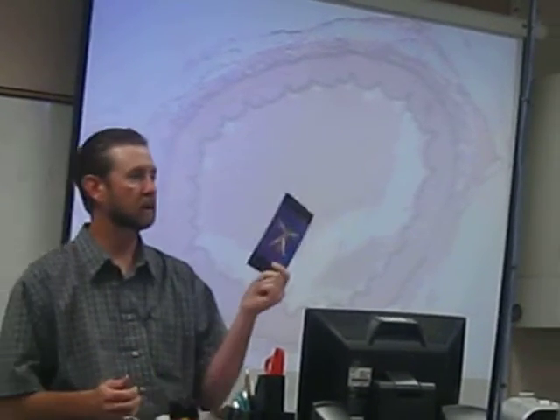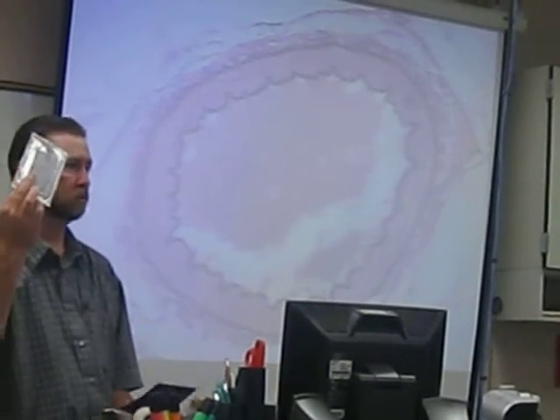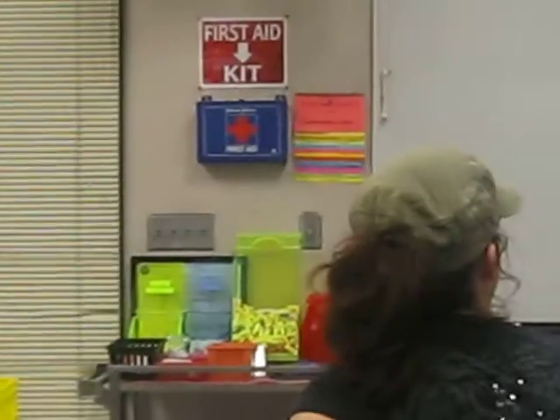some blood typing. We have the Eldon cards. It's a semi-crude way of doing your blood typing, but it's pretty accurate most of the time if you do it right and you get a good blood sample. Up here in the front on the cart, we have the little pamphlet. It tells you about the blood typing and goes through it. We'll talk about this in lecture as well.